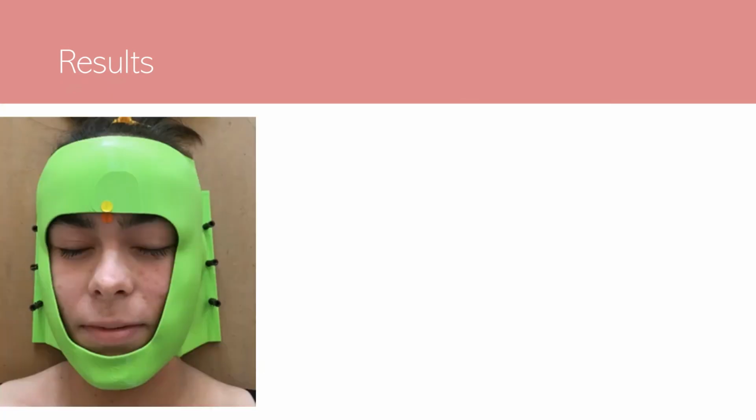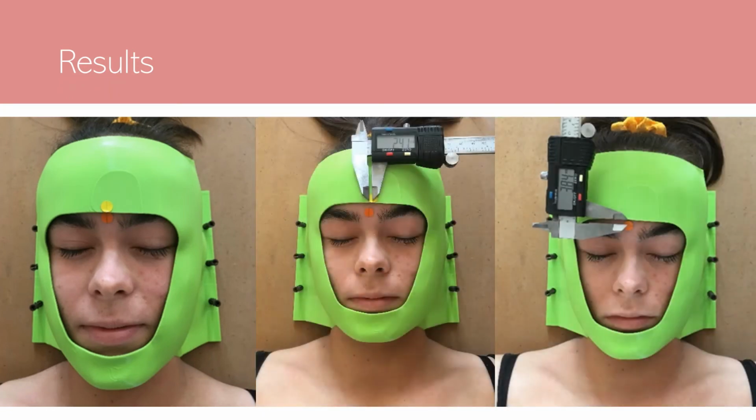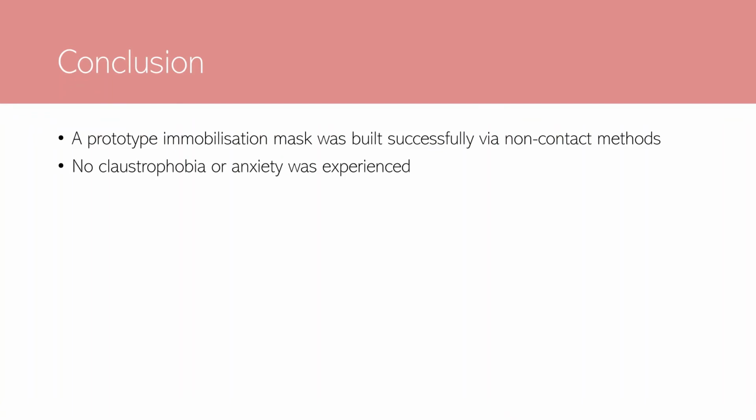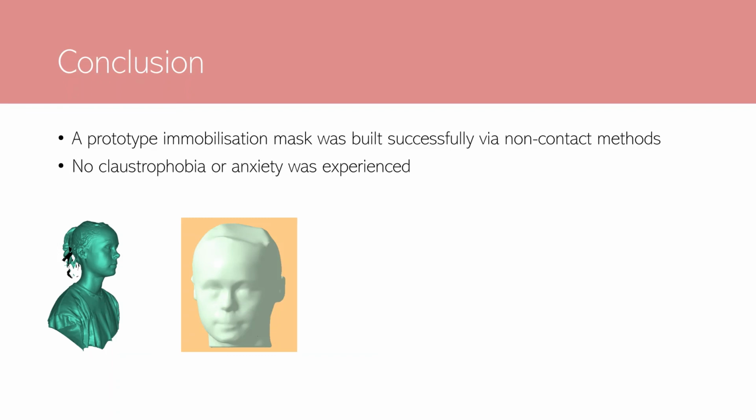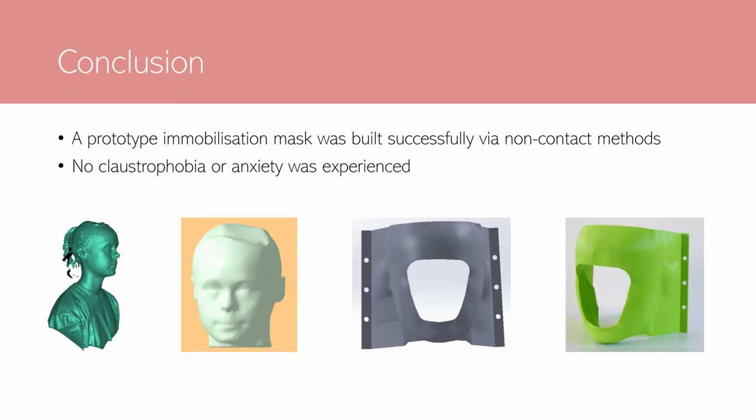The time a patient is required for an appointment is similar to the current process, however mask production is considerably longer, but it can be left overnight to print. A prototype immobilization mask was successfully created which restricted patient movement without the individual experiencing claustrophobia or anxiety. Mask production is longer and has a greater total cost than the current process, however this is expected to reduce over time with advancements in technology.